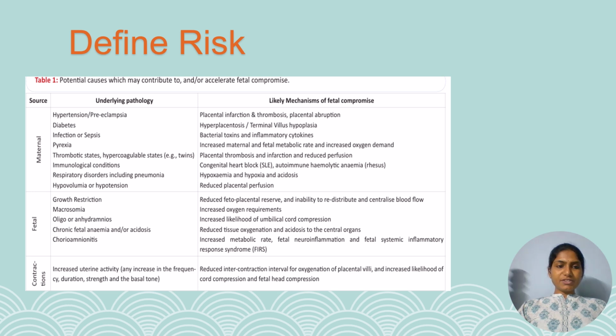So I mentioned earlier that we have to define the risk. These are the important causes which might contribute to or accelerate fetal compromise. That is why we have to be very much vigilant during the process of labor or in the antepartum period. So these are the maternal and fetal indications for doing a CTG, that is an antenatal or an intrapartum CTG.